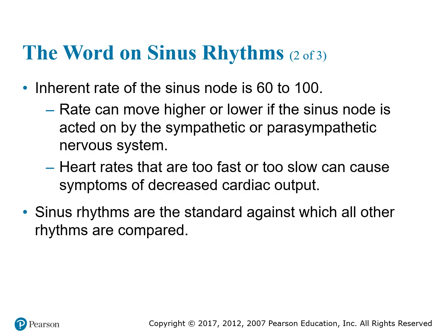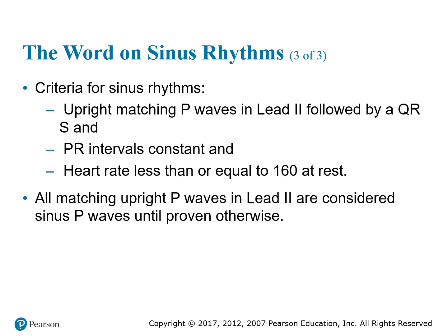Sinus rhythms are the standard against which all other rhythms are compared. So every other rhythm that you look at, if it's not a sinus rhythm, it's not normal. This is the way that they look at it, and everything is compared to a sinus rhythm. So, criteria for a sinus rhythm.